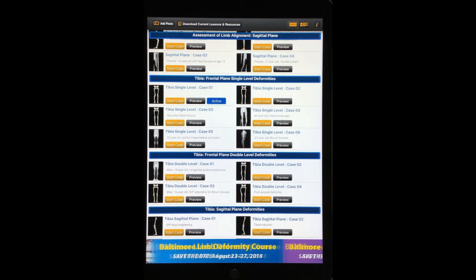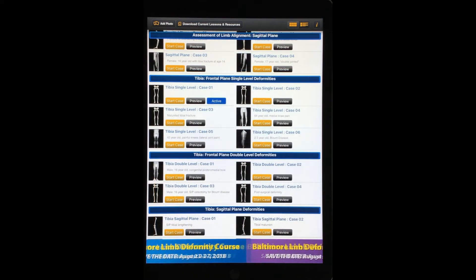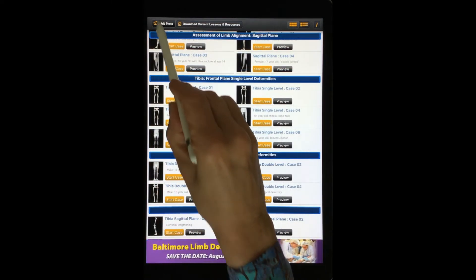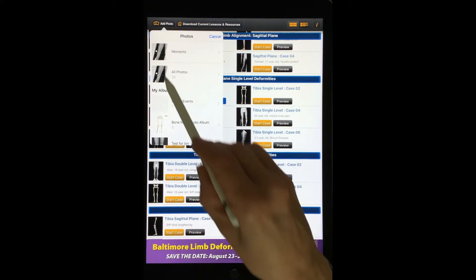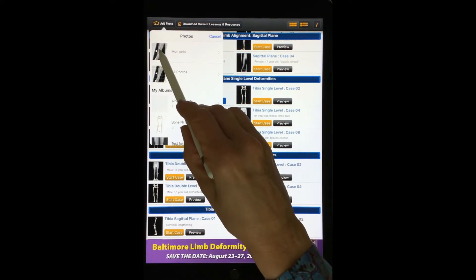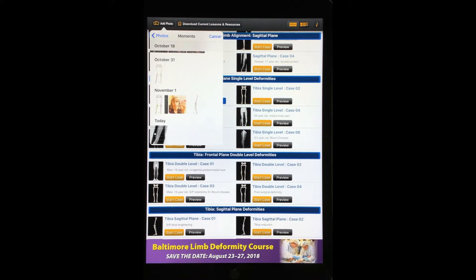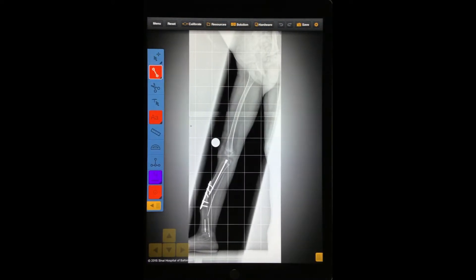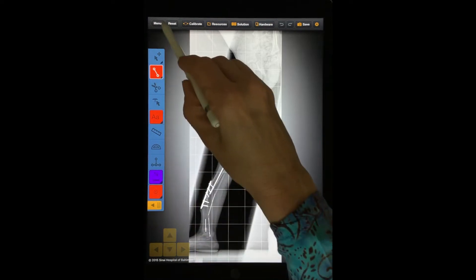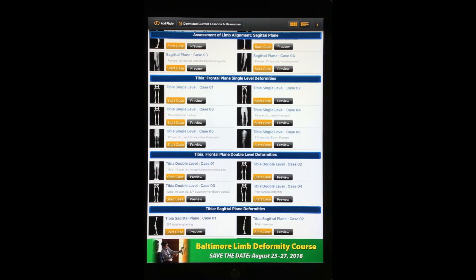You can upload your own case example into Bone Ninja. Select the Add Photo button to work on a radiograph or image that is already in your iPad's camera roll, photo stream, or Bone Ninja photo album. Alternatively, you can work on a pre-loaded case.